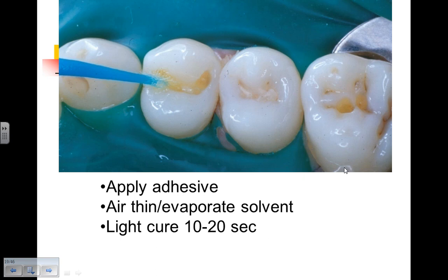The light's going to be touching the occlusal surfaces of the teeth as close as possible and at right angles. The operator's wearing orange glasses, or they're using the orange shield to use the orange as a blue blocker of the blue wavelength light coming off the light emitting diodes, the chipset of the curing light.